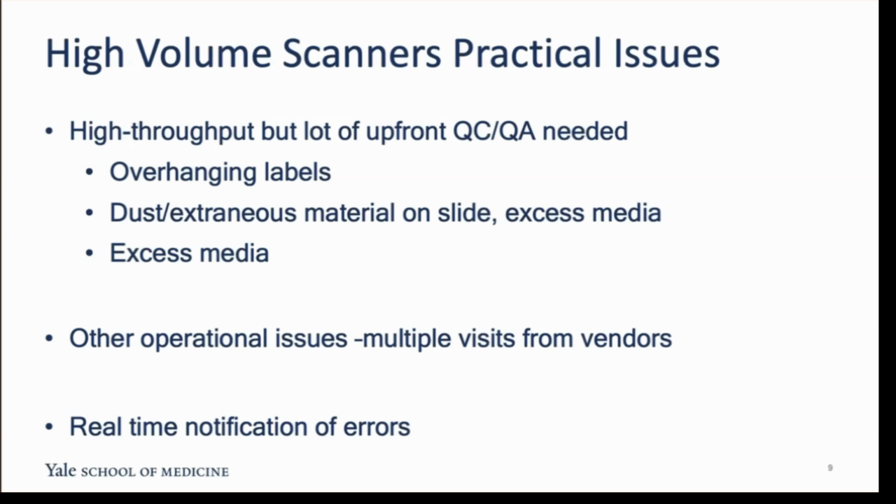Independent of that, in the initial phases, we had quite a few operational issues. In fact, it triggered multiple visits from the vendors because we kept having these error messages. And for a long time, we could not figure out what was causing it. But anyway, after multiple rounds of troubleshooting, we reached a point where the slide handling errors were more of a nuisance rather than an existential crisis every day.